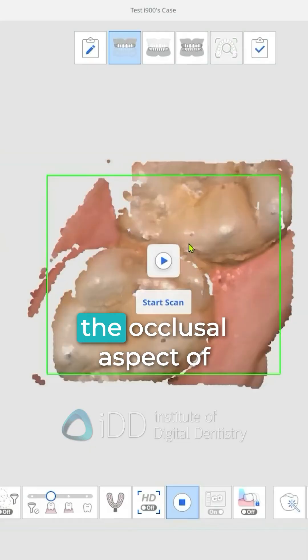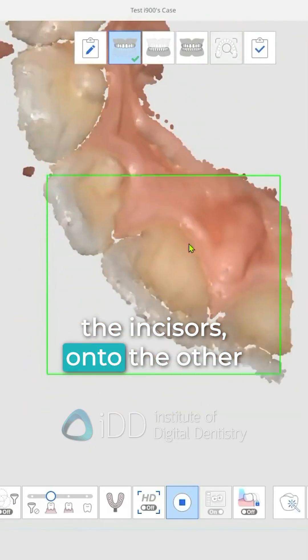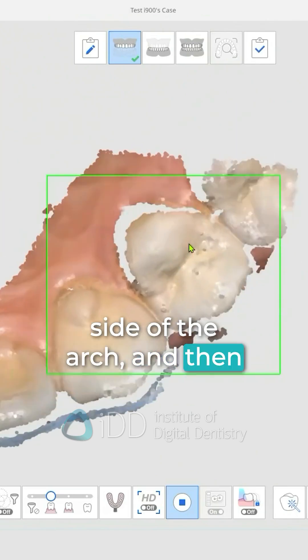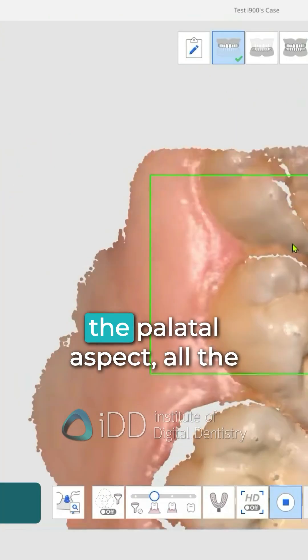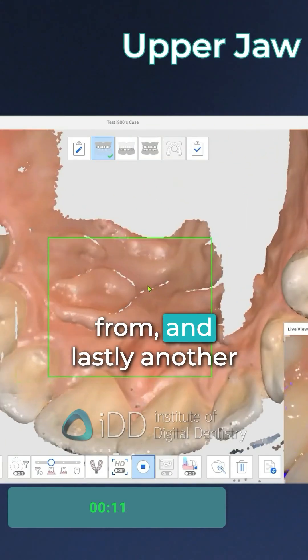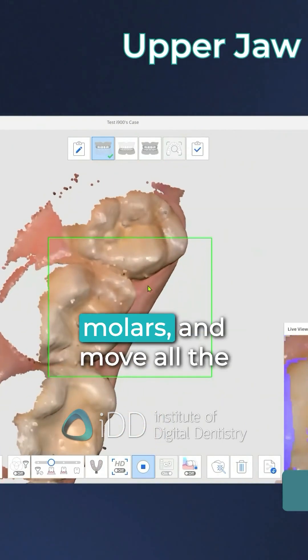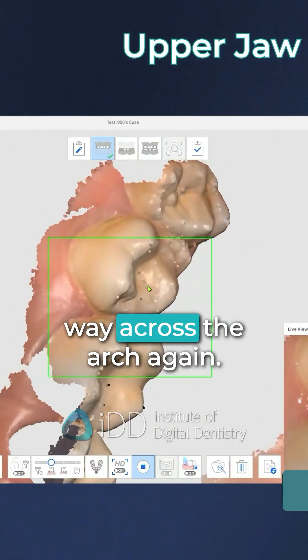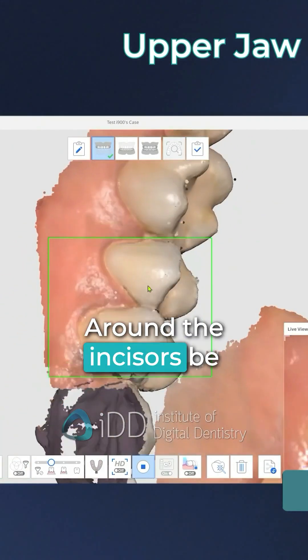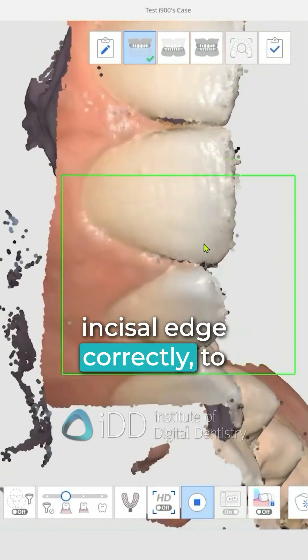We start with the maxillary arch on the occlusal aspect of the molars, moving across the incisors onto the other side of the arch. Then we rotate the scanner to scan the palatal aspect all the way to the side we started from, and lastly another rotation to scan the buccal aspect of the molars, moving all the way across the arch again around the incisors. Be extra careful to capture the incisal edge correctly.